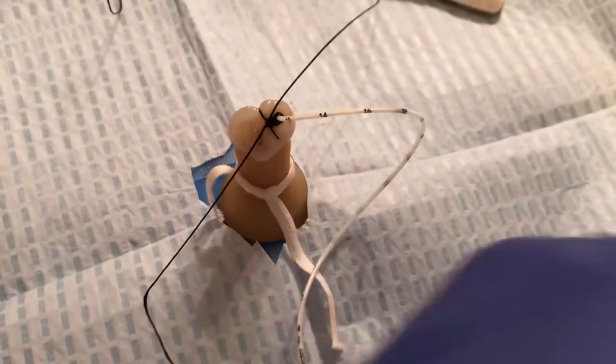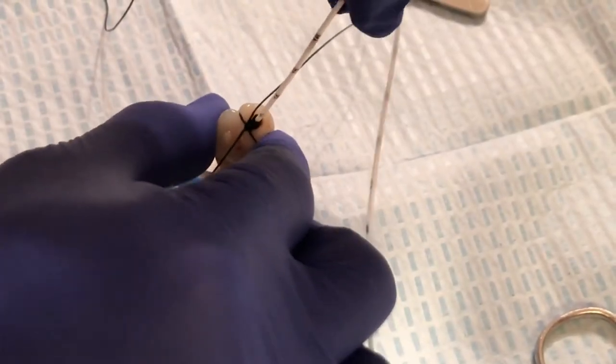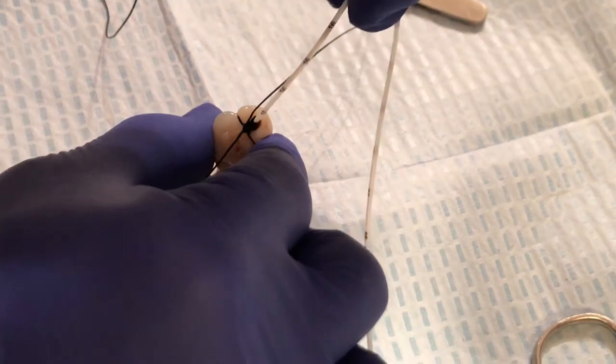Now we want to test the security of the suturing. Give it a really good tug — a good pull — to make sure that the catheter is nicely staying in place.